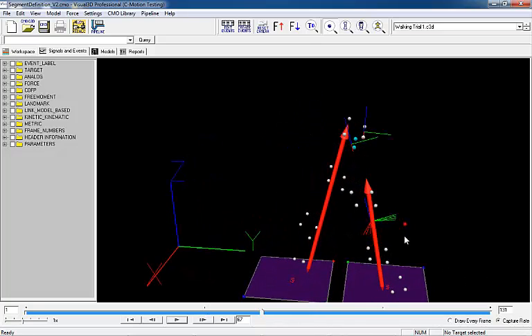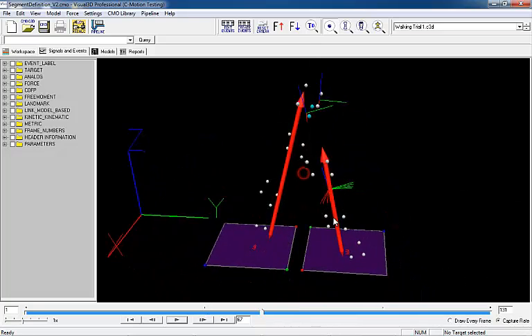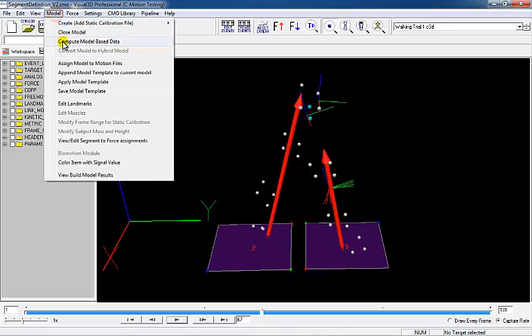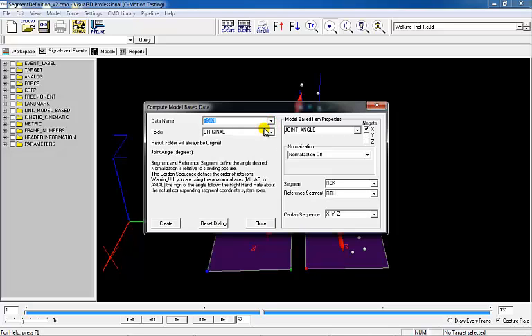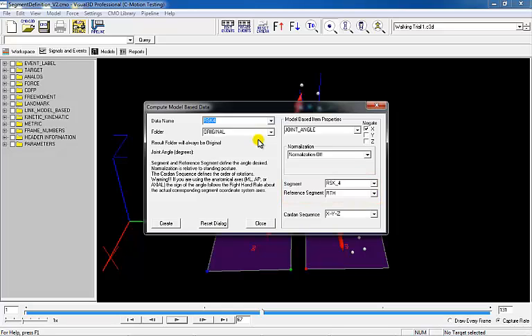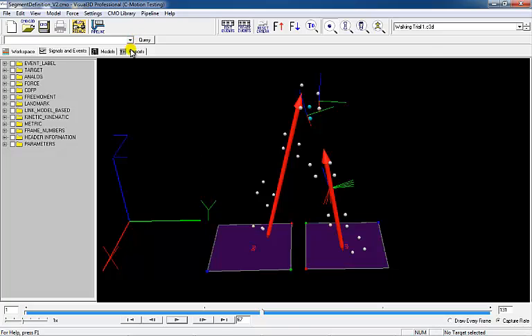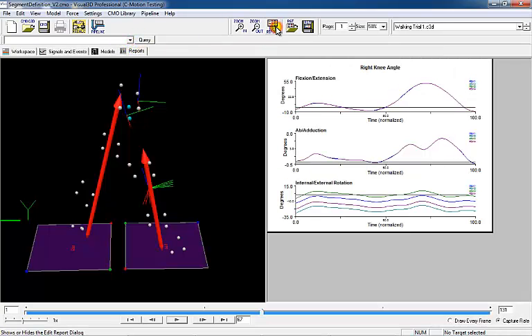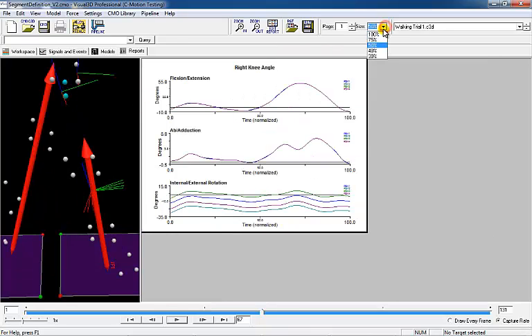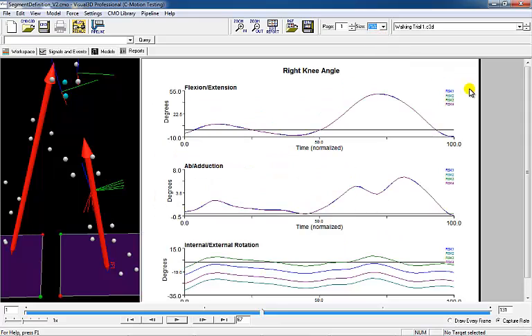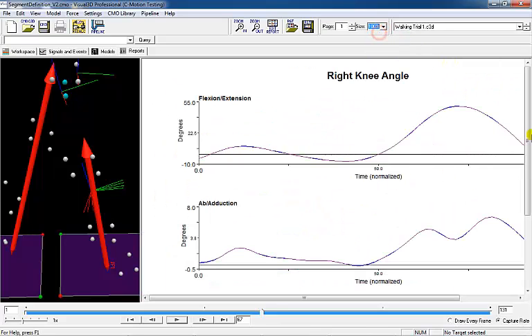If we move to Signals and Events, we can see the multiple coordinate systems in the 3D viewer. To look at the knee angle, I created four signals called RSK1 through 4. By going to Model > Compute Model Based Data, I created four knee angles with a reference system of the thigh, and the segments being each of the different shanks. In the Reports tab, I graphed the four shank segments in X, Y, and Z. The Z depicts the internal and external rotations. You can see that since my axes were rotated about the Z when I created my model, the internal and external rotation of the shank segment was affected the most.